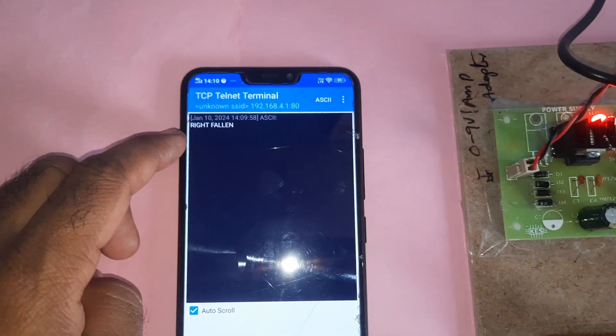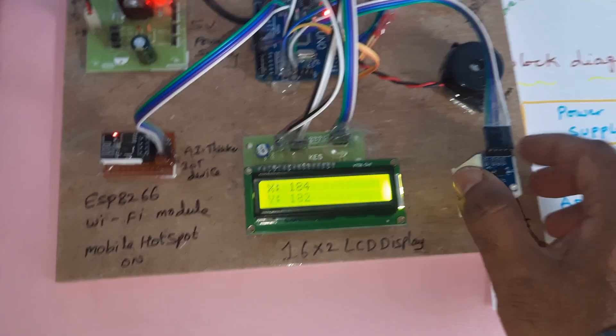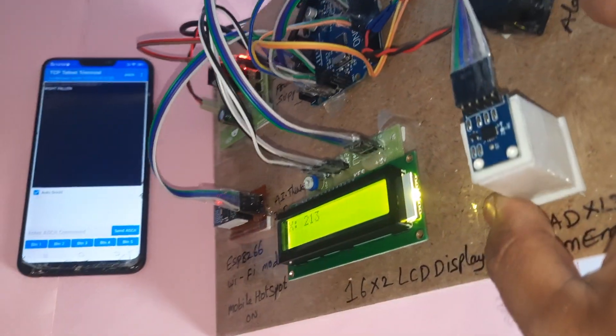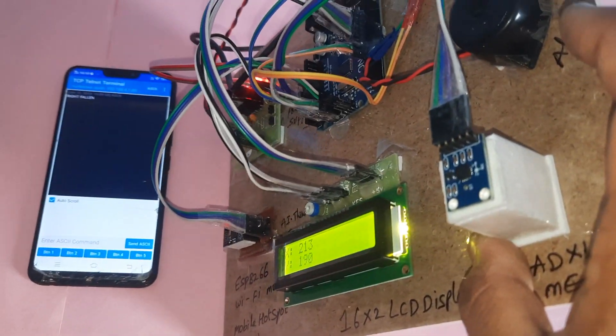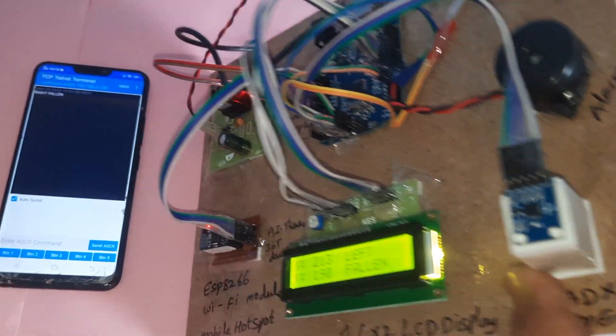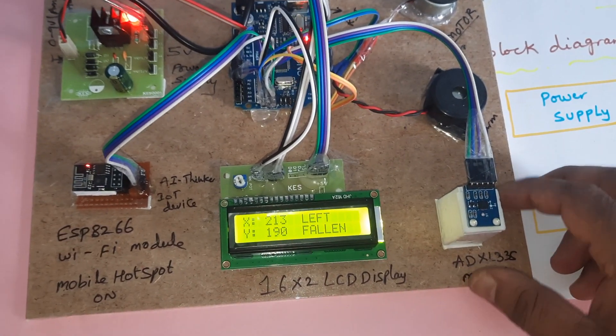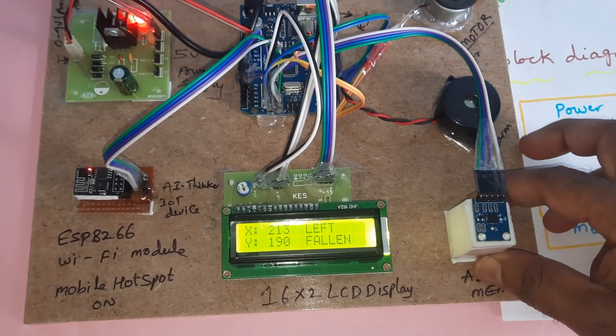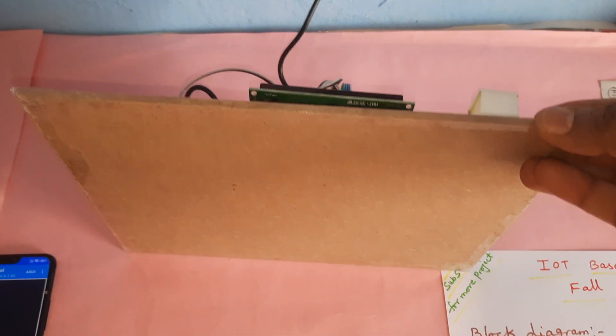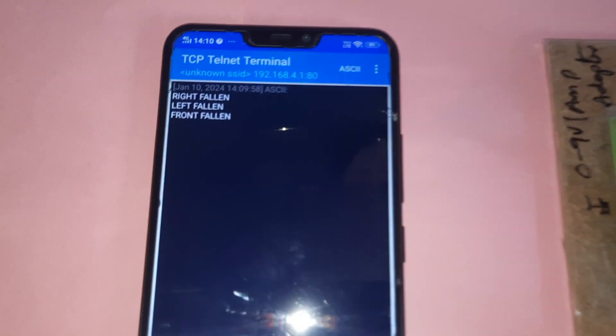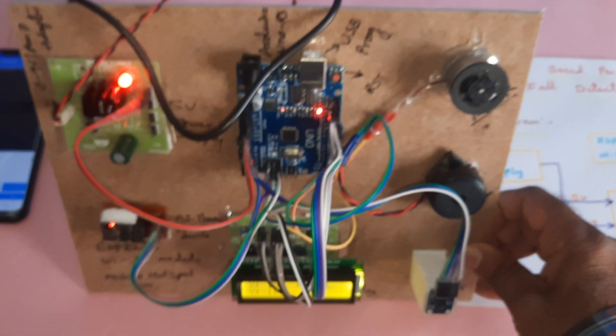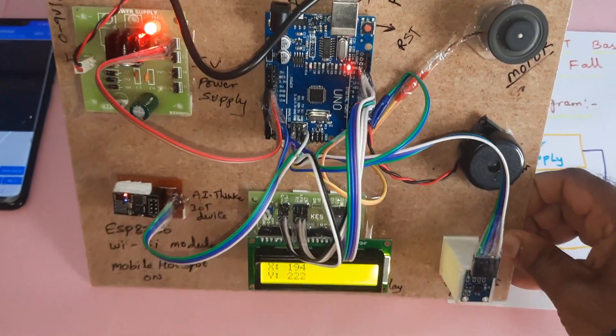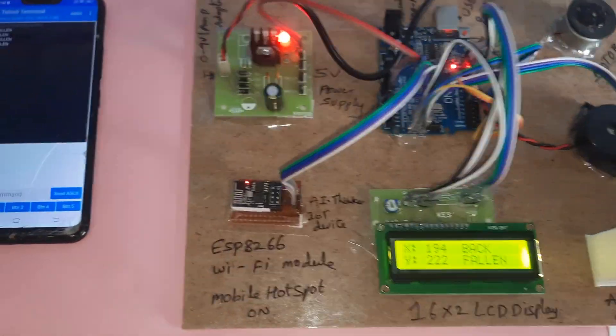Right fallen, left fallen, front fallen, front fallen, back fallen.